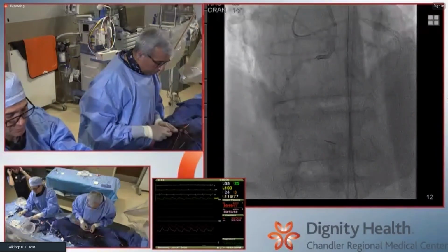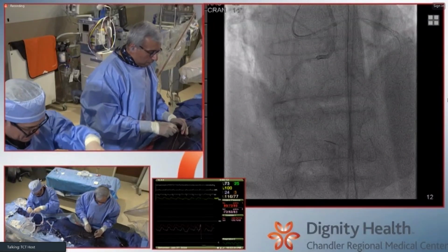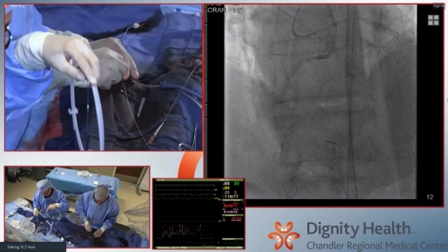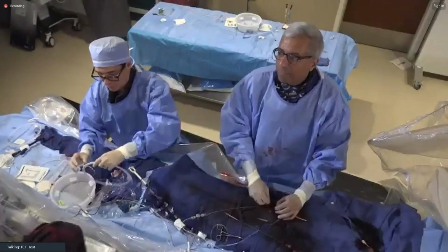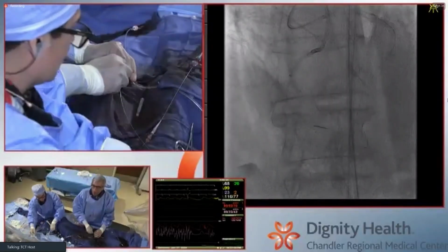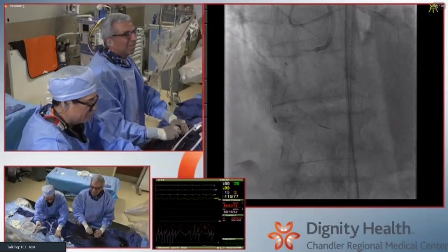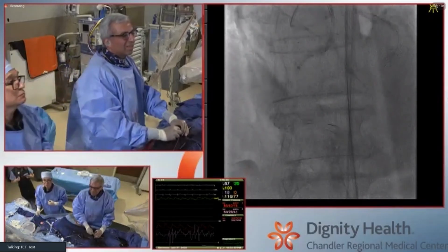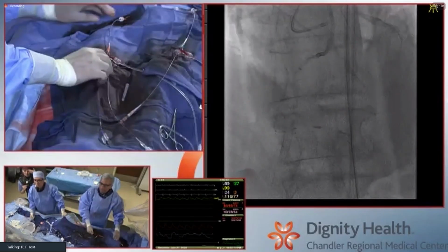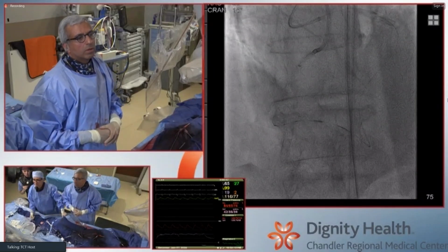Thank you. So from a prep strategy perspective, given that you've got dense calcium through that subintimal segment, but proximally it's not that bad. Still, that's more than 180. We consider the region inside should be larger, because the reference site is always smaller than the maximal site. Our cutoff is 180. If the proximal intraplaque or proximal to the CTO segment has more than 180 degrees of calcium, we expect inside the CTO segment should be really large and we must be careful. Can IVL be useful in this setting for fracturing and stent expansion?